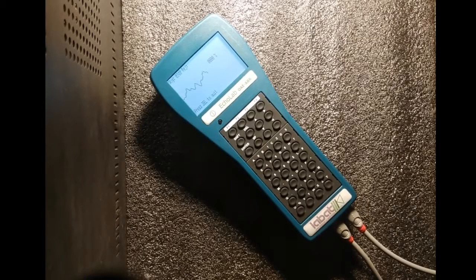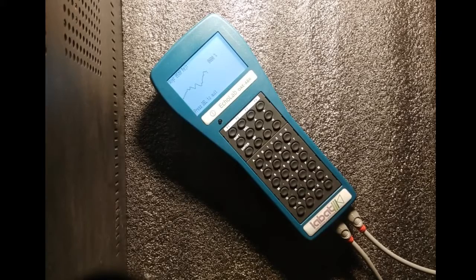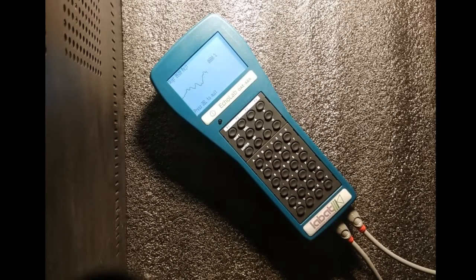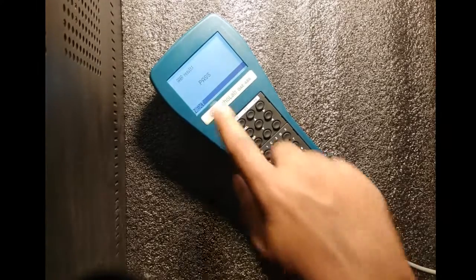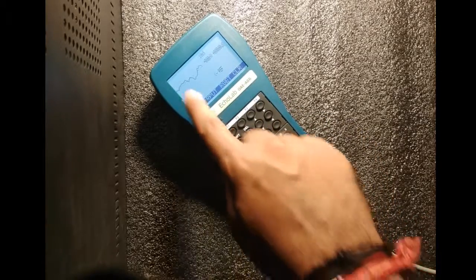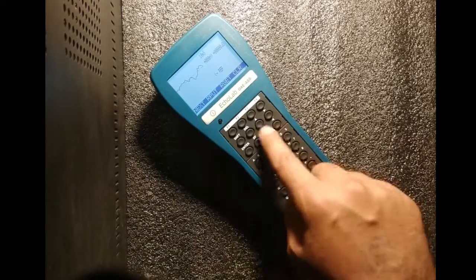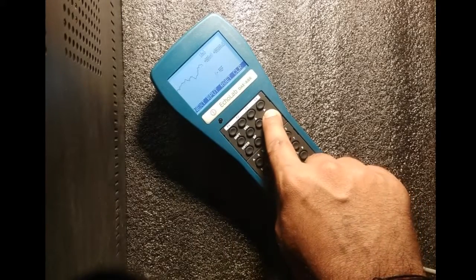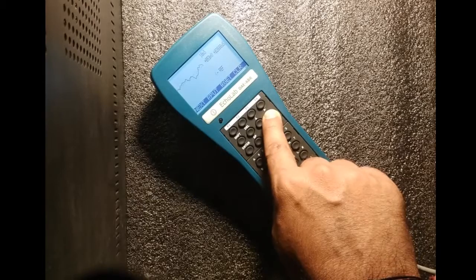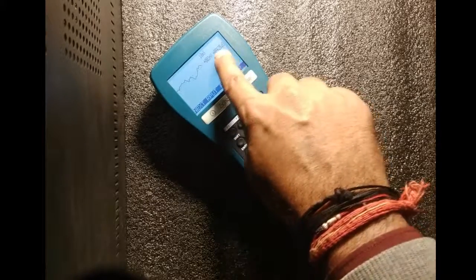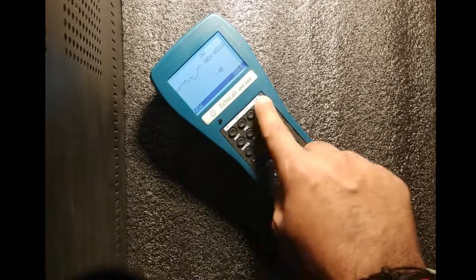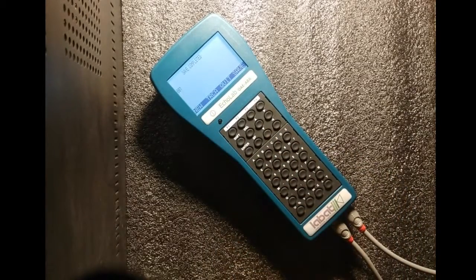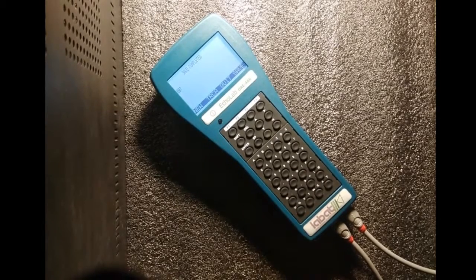Now it is showing the pass result. I'm pressing next and it is showing me the waveform. You can use these arrow marks to check the peak values. You can see it is showing the time over here. Now you can hit next and then save the test, and later on you can import the test from the equipment to the PC.